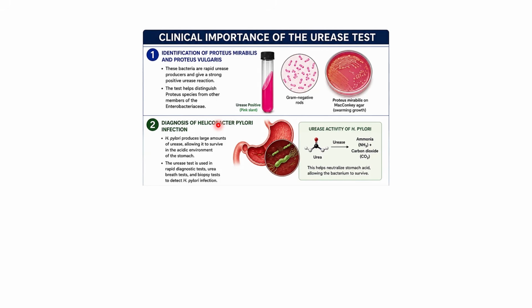2. Diagnosis of Helicobacter pylori infection, or H. pylori. H. pylori produces a large amount of urease, allowing it to survive in the acidic environment of the stomach.